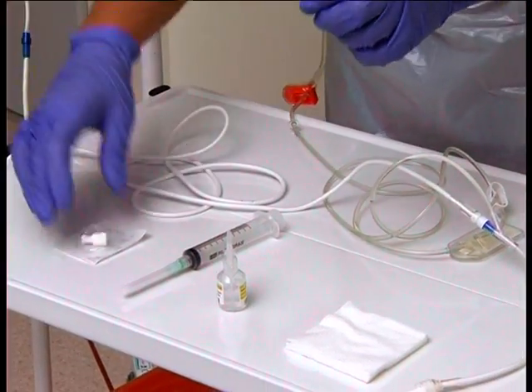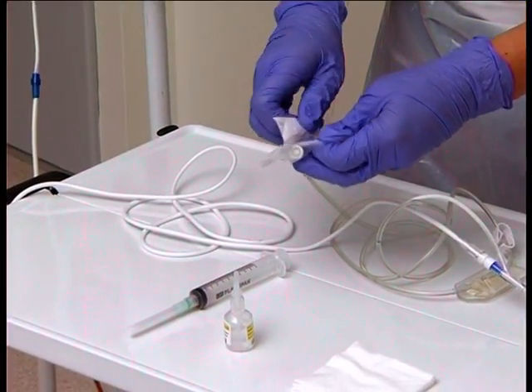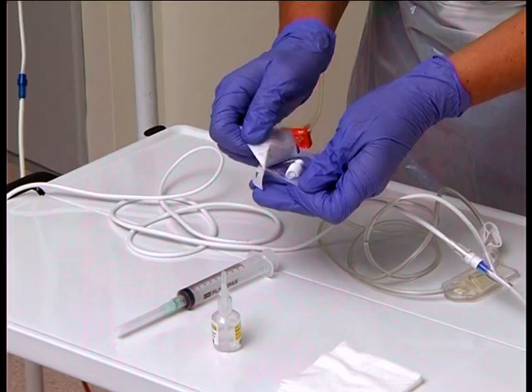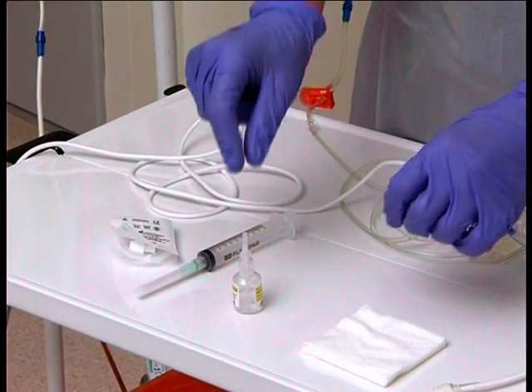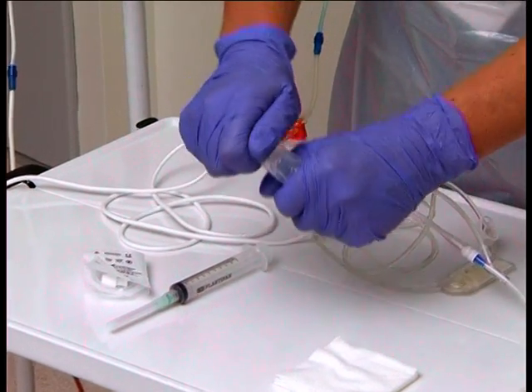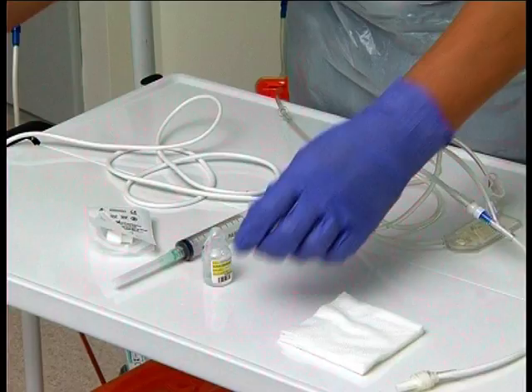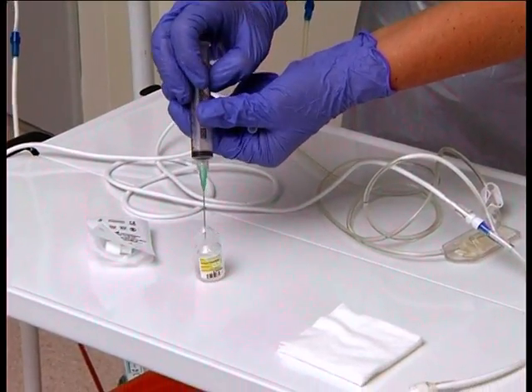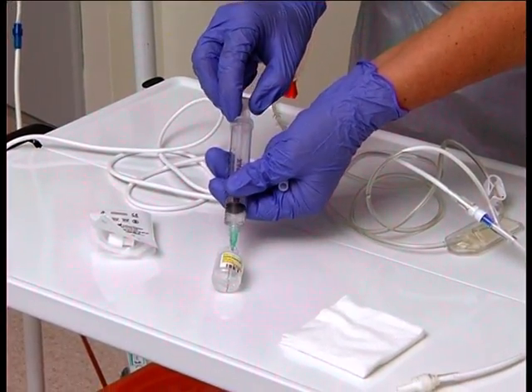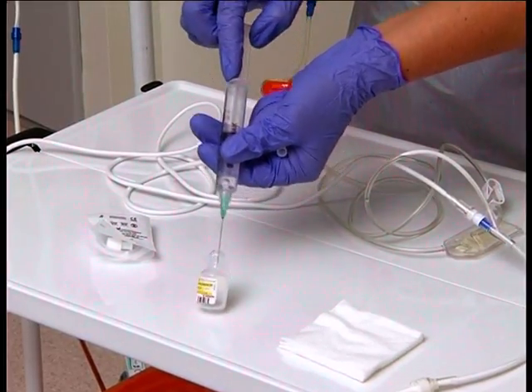Partially open the end cap packaging to allow easy access when it is needed. Cover back over and place it on your trolley. Remove the top of the 0.9% sodium chloride vial, taking care not to touch the area where it breaks. Put the vial back down onto the top of the trolley and throw the top away in the rubbish bag. Remove the green needle cover, leave the vial on the trolley surface and put the needle into the 0.9% sodium chloride vial and draw up at least 5 ml.